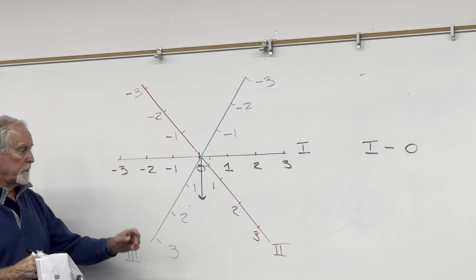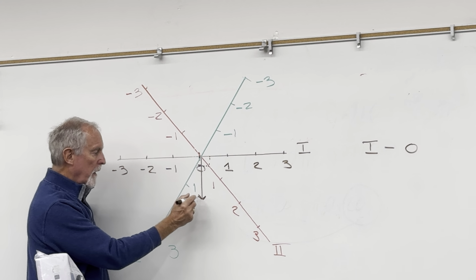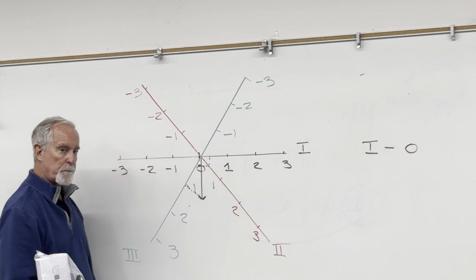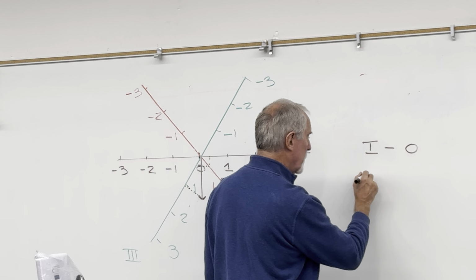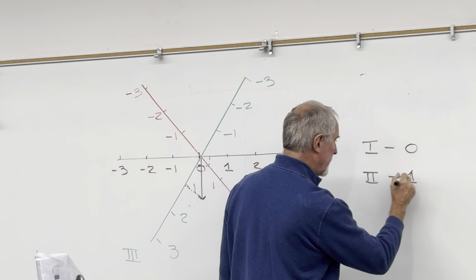So to get lead 2, I'm going to take this point here, the furthest point of this arrow, and I'm going to drop a line to where it intersects this axis perpendicular. And so you're going to tell me in lead 2 the value is going to be what? 1. Correct. Everybody with me on that or not? So in lead 2, we would see a value of 1.